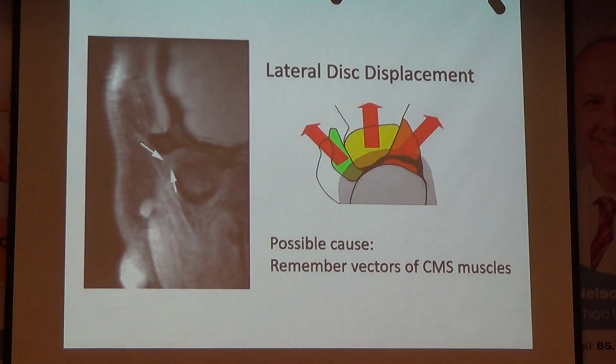And you can clearly see these displacements in any place. For example, in this case here, I have displacement of the disc to the side.